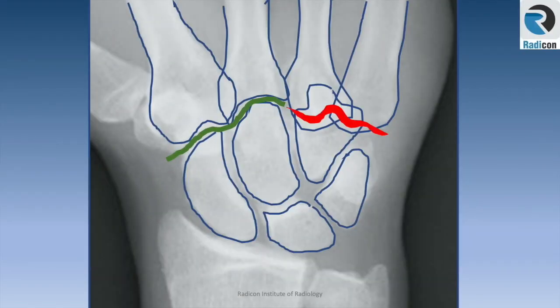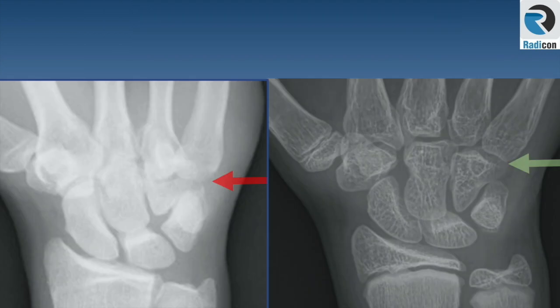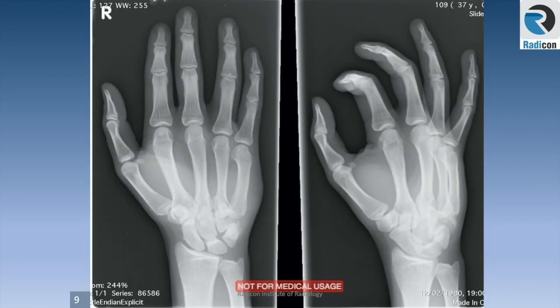Let's put a normal and abnormal CMC gap side by side. There is overlapping or impaction at the bases of the 4th and 5th metacarpal and the hamate bone. So this is a case of fracture dislocation of the 4th and 5th CMC joint, and you can see how clear it was on the zoomed-up images.